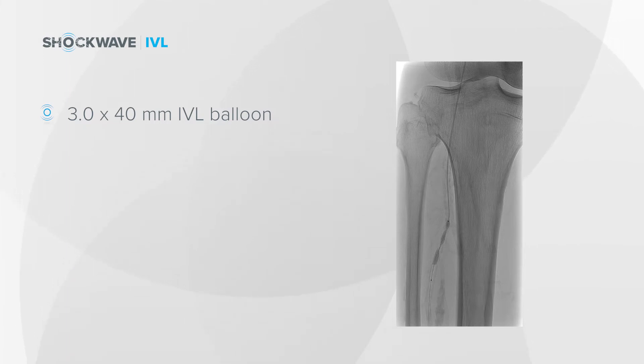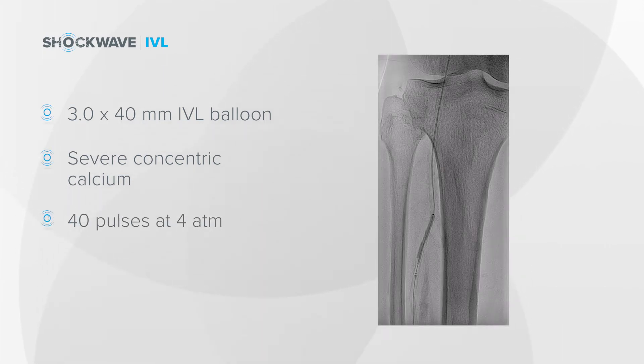You can appreciate here that the vessel had really severe concentric calcium, and the IVL balloon initially had very minimal expansion. But then over the course of 40 pulses at four atmospheres, I was able to get this balloon to inflate significantly and get a good angiographic result of balloon angioplasty to this segment.